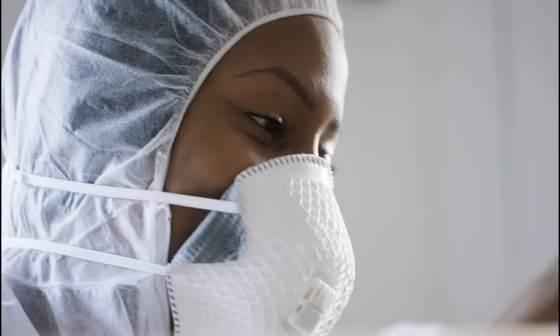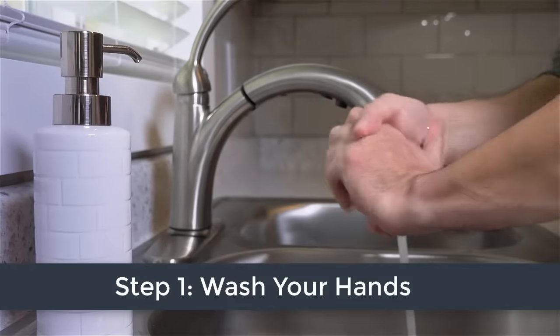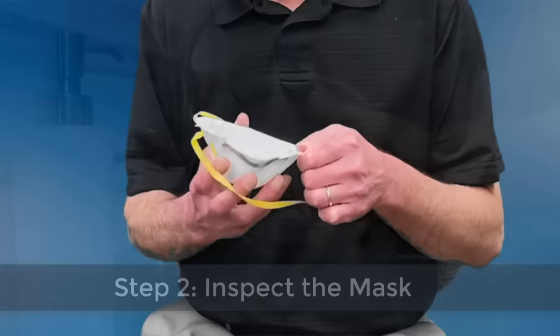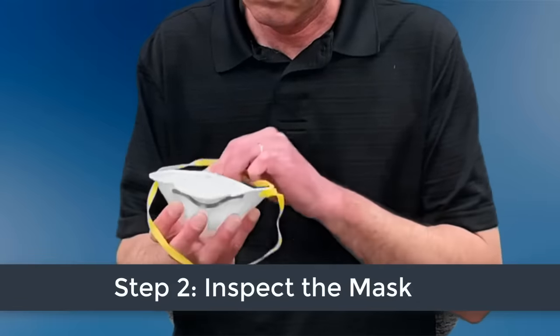When wearing a mask for work, the following steps can help you correctly put it on and take it off to keep yourself and others safe. First, wash your hands thoroughly and inspect your mask. If it appears damaged, do not use it.